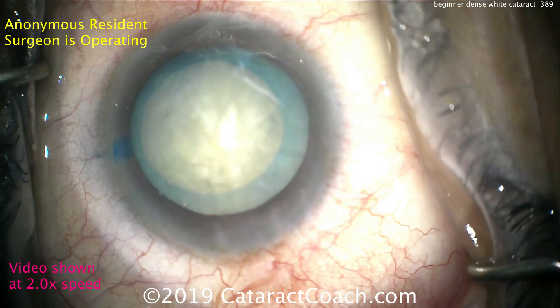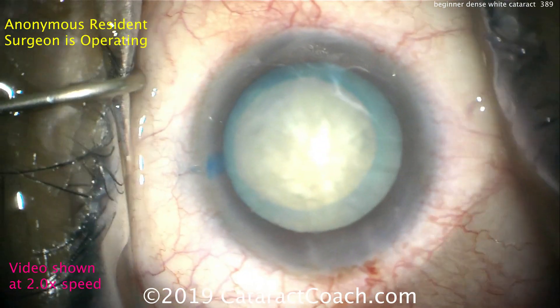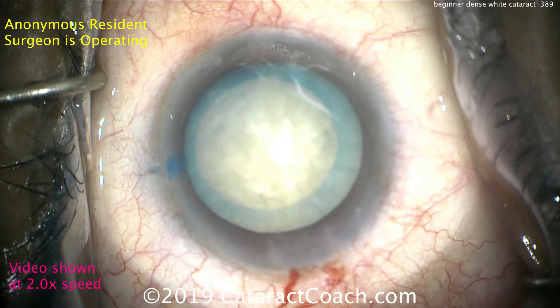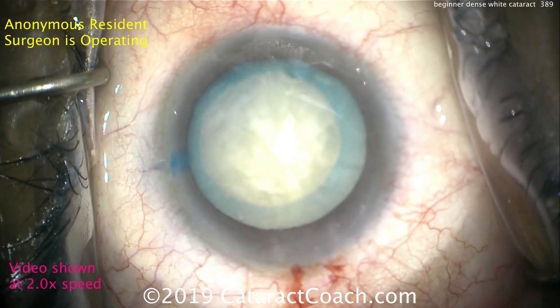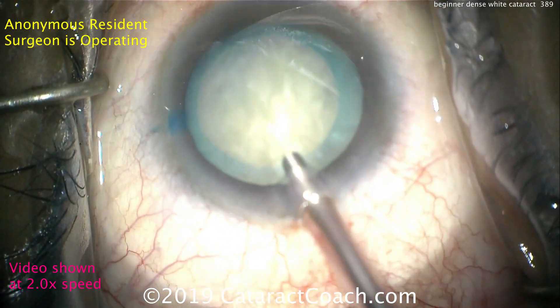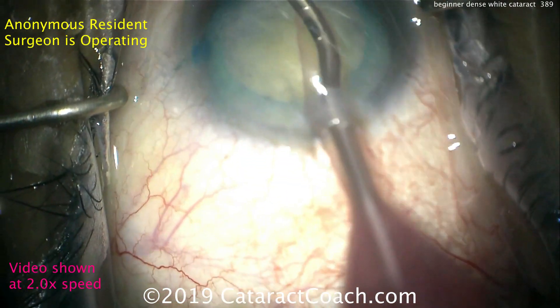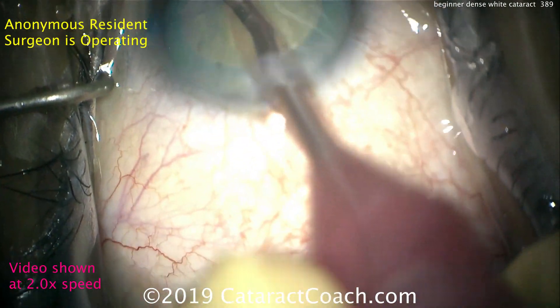Looks like some adjustments are being made with the phaco probe. Let's look at the lashes — draping looks good, lashes are out of the way. Good draping, good eye position, nice exposure. The iris is parallel to the floor of the room, and the eye is in primary position during this procedure. Now there's the phaco probe — looks like a bevel-up orientation, or maybe bevel down. Cleaning up some of the anterior cortex, it appears.